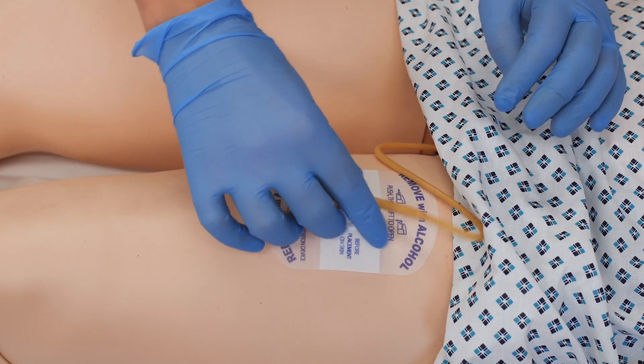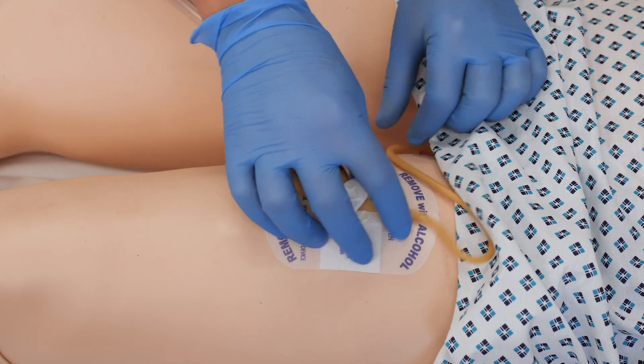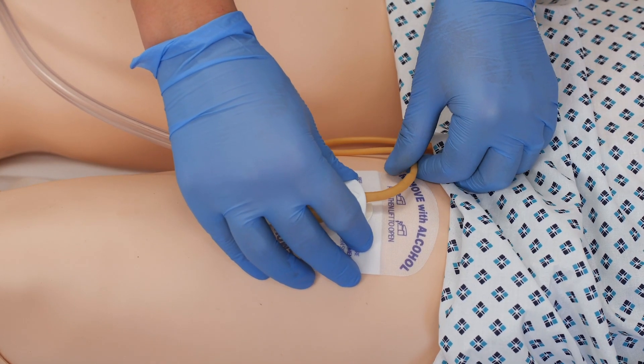The device has a spinning function so it's not set in place. This allows the patient movement and allows them to mobilize. It keeps the catheter stable but does give that bit of flexibility as well.